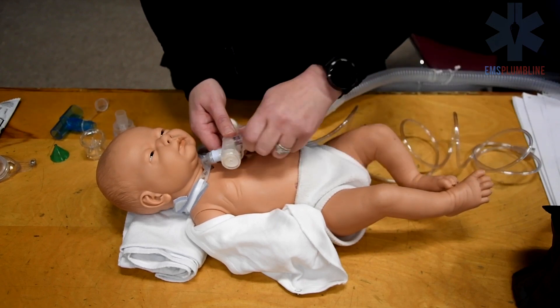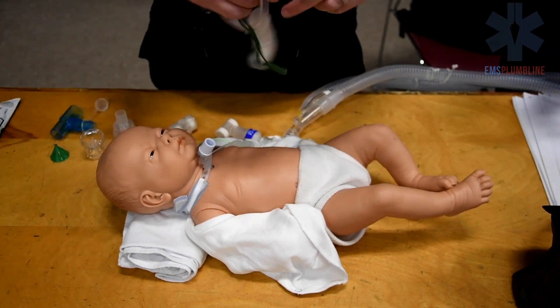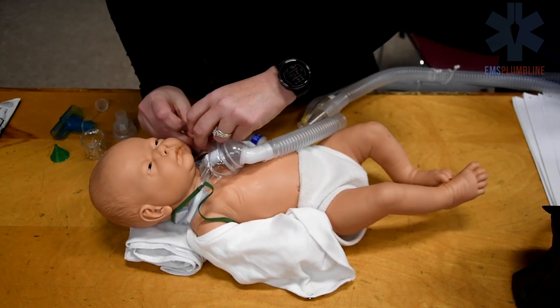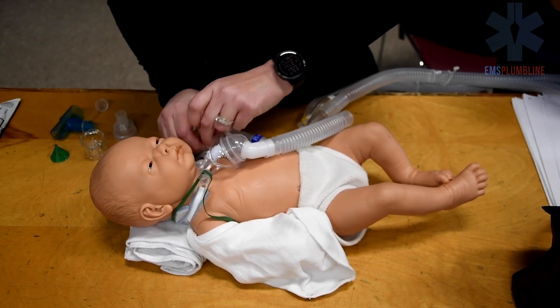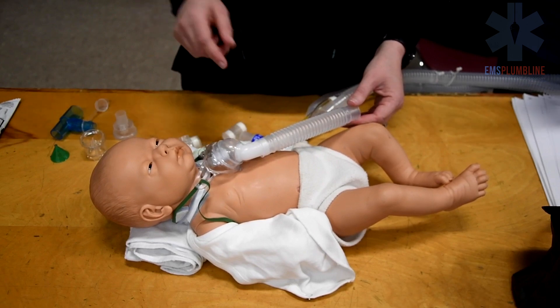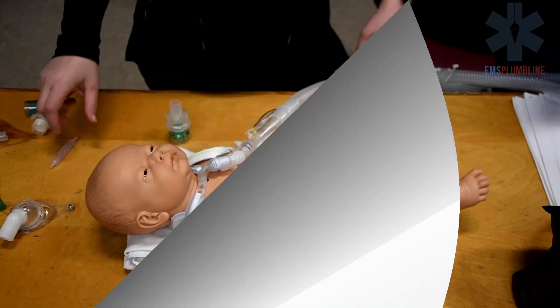When giving a nebulizer, it should always be given via the trach mask. Attach the nebulizer cup to the end of the mask and then attach the air or oxygen tubing to the end of the nebulizer cup. Never administer a nebulizer directly connected to the trach tube, as this forces air into the lungs without a way for air to escape. This can create a pneumothorax, or popping of the lungs.